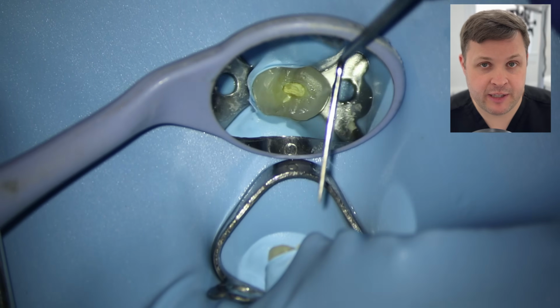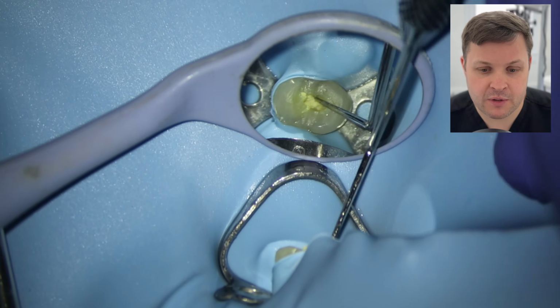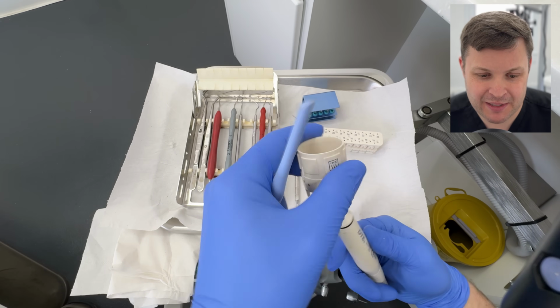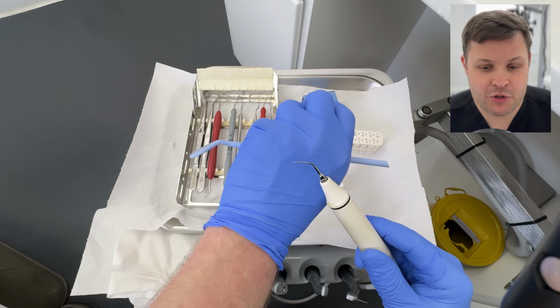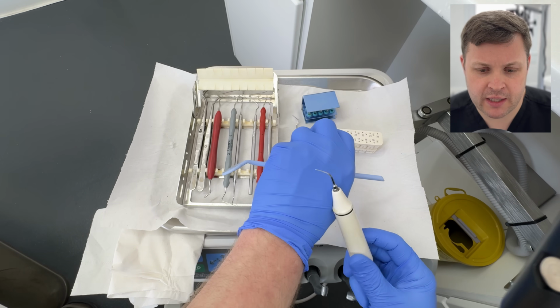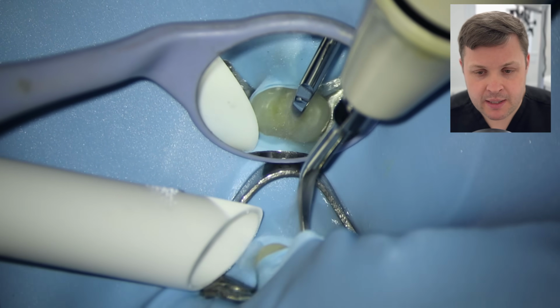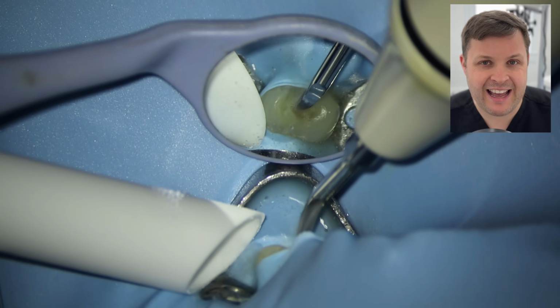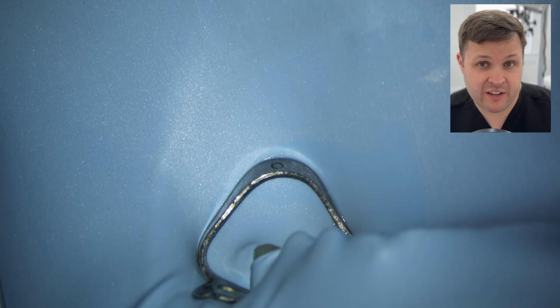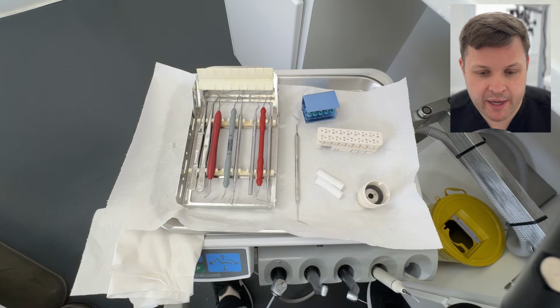I'd done the composite filling buccally, but he'd accessed this tooth, and he's pretty good, this guy, because he uses PTFE just like me. Once we've removed the dressing, it's looking a bit nasty inside the pulp chamber, so I'm going to use an ultrasonic tip here. I like to use these perio tips, mainly because they can get into the canal space nice and easy, but the problem with perio tips is the thinner they are, the less energy they have, so it's a bit of a trade-off.